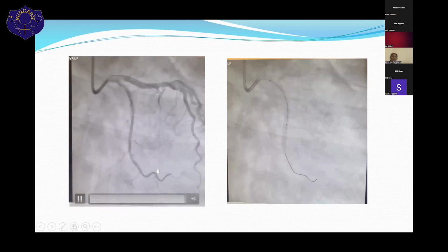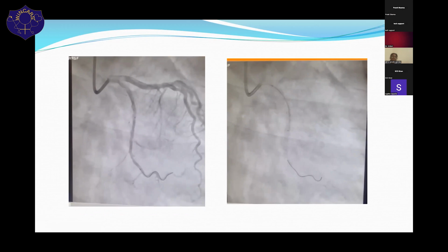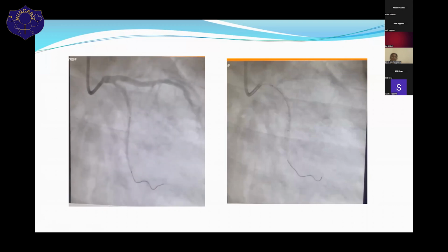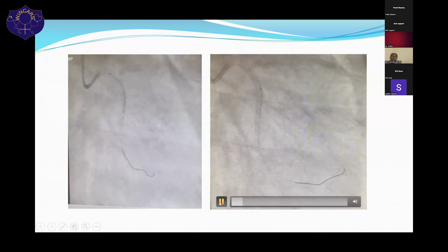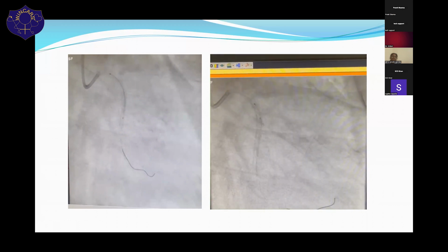2.75 32 Yukon Choice sirolimus eluting stent, and proximal LCX is stented with a 3.5 36 balloon, 36 stent Yukon Choice. So this is the proximal segment. We placed the proximal stent into the ostium of the LCX. So after stenting, we post-dilated both the stents with a 3.5 12 NC balloon.